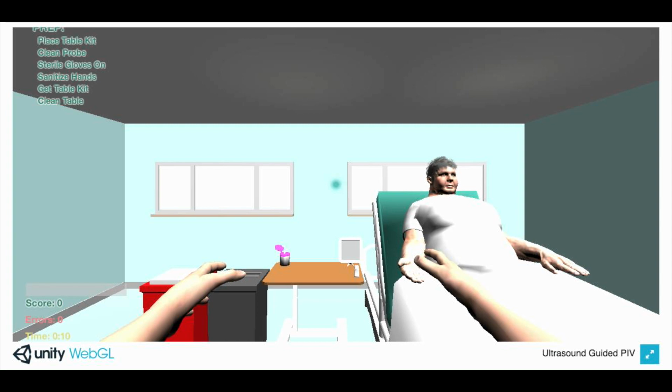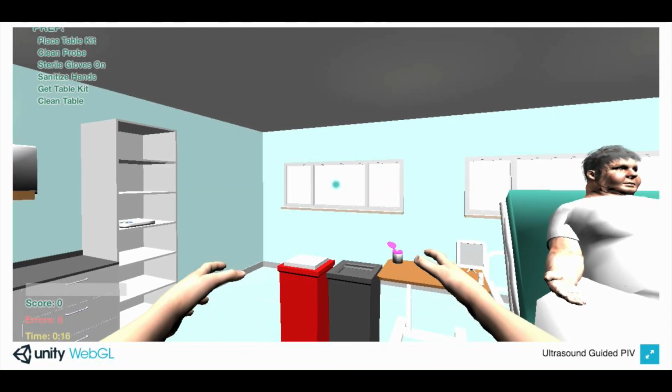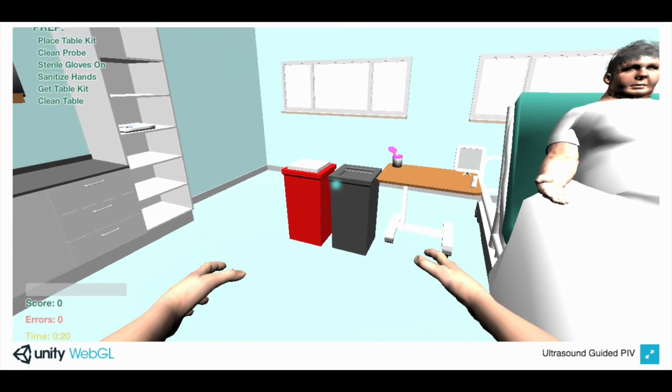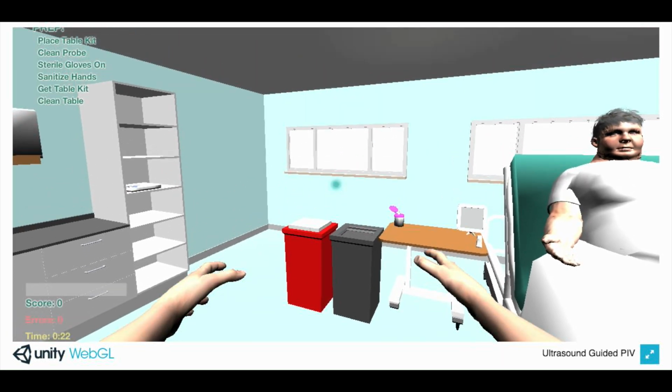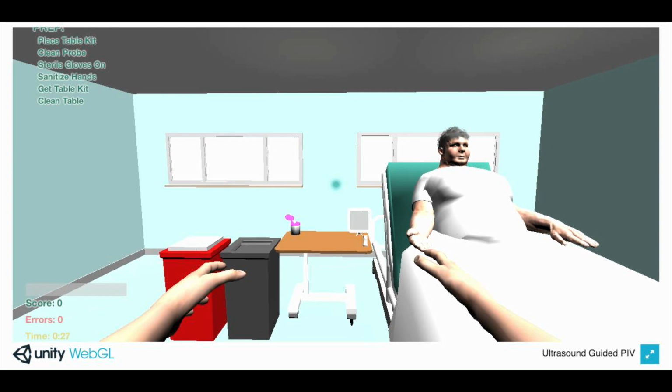Your movement is multidimensional. If you want to see what's to the left, move the blue dot on the screen to the left using your mouse. If you want to look down, move the dot on the screen down. You get the picture. Move the dot in the direction you want to look. Secondly, if you want to move closer to an object, use your arrow keys.